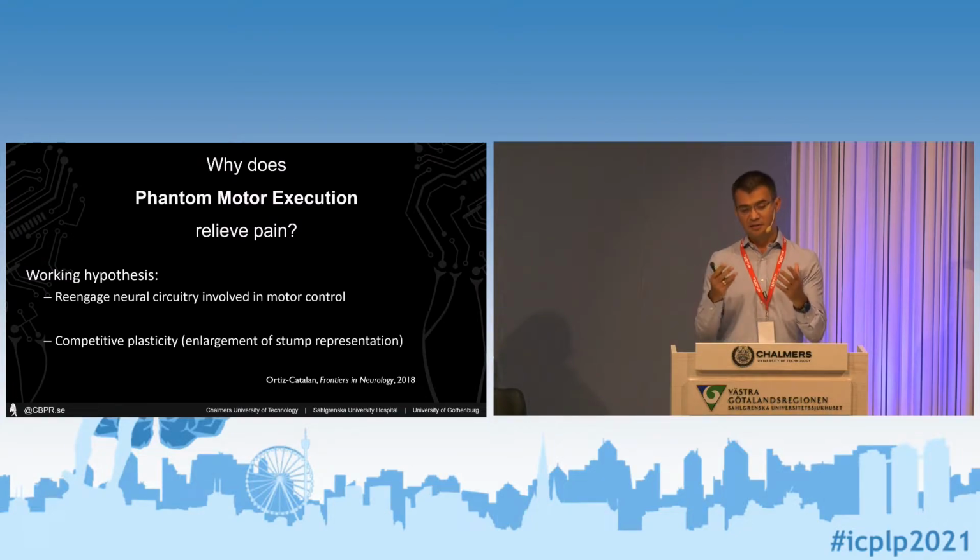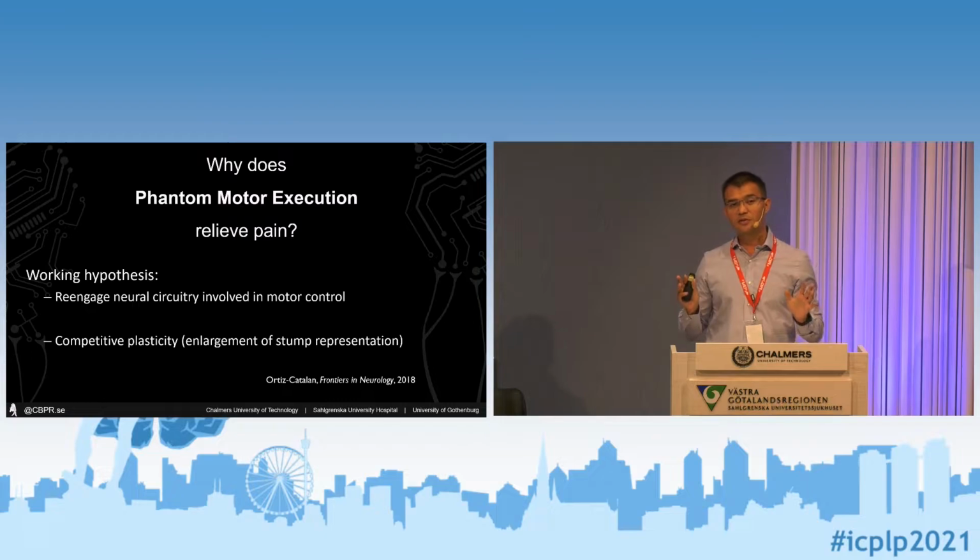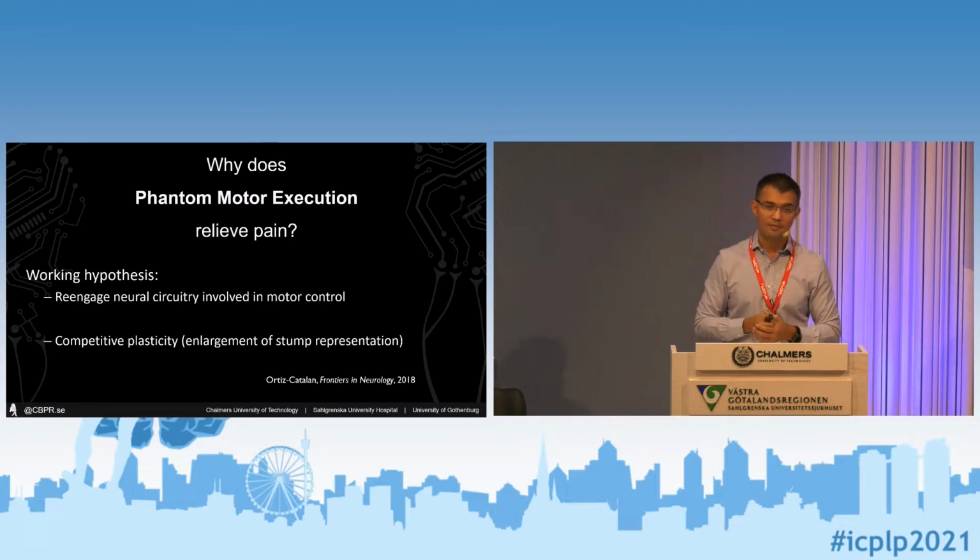be to explain, and there is a path of treatment based on explaining pain. That is one area of research in pain, for instance. So explain some of these ideas and say that if you try to do movements in the mirror and you actually try to execute them and focus on the motor and how it will feel and what you feel in the stump and so on, that will be more useful. So myoelectric pattern recognition, virtual reality, augmented reality, they are tools to help this therapy.